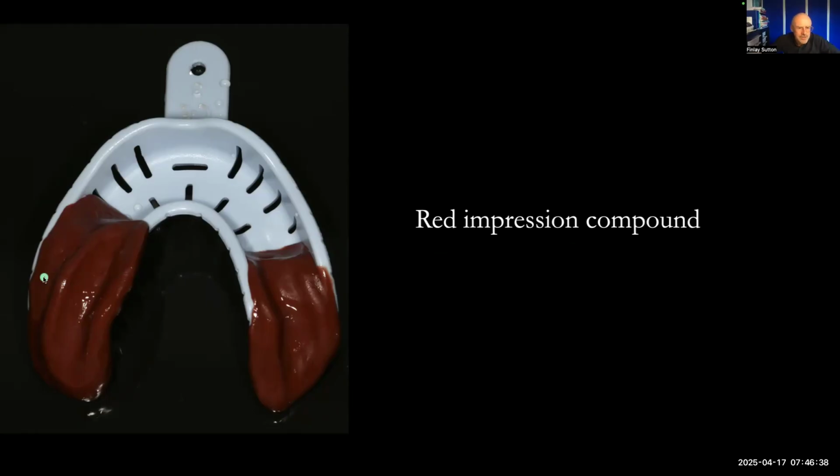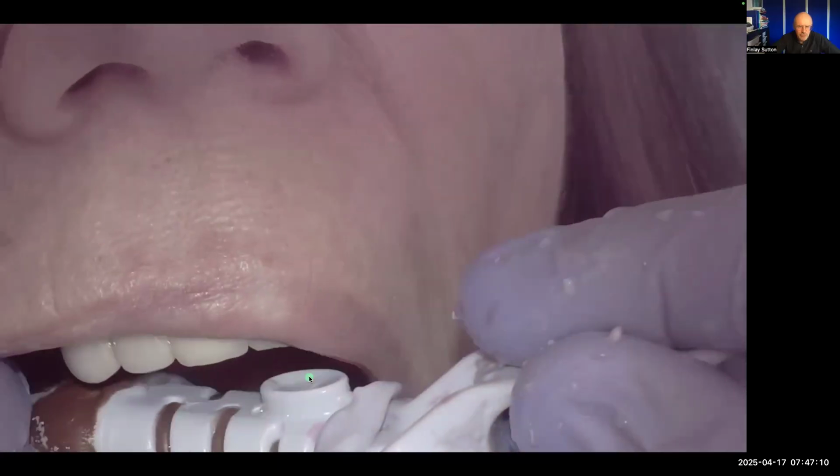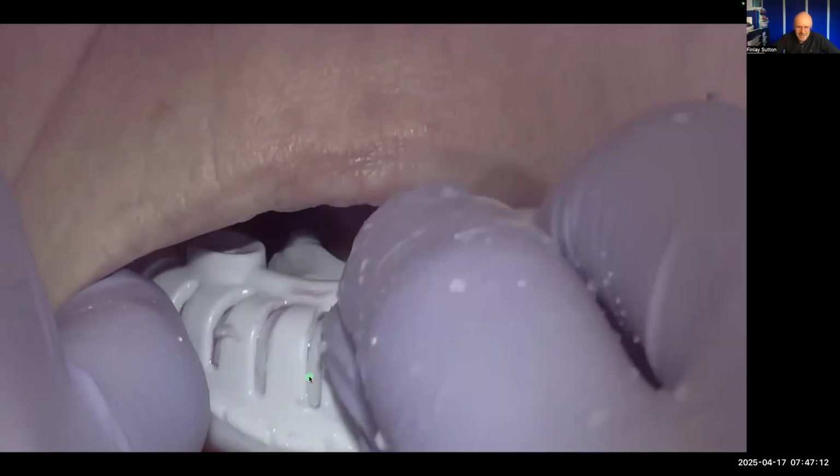So what I do is mix up some red cake compound and push that into the mouth to record the free end saddles there. Then I mix up some alginate, put that into the tray, and rub the alginate into those abutments. So this is for my primary impression. Just pick up the alginate, rotate it in, sit it down.